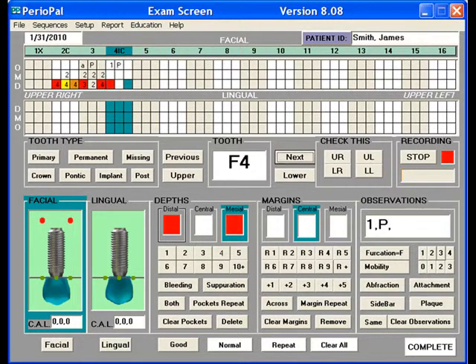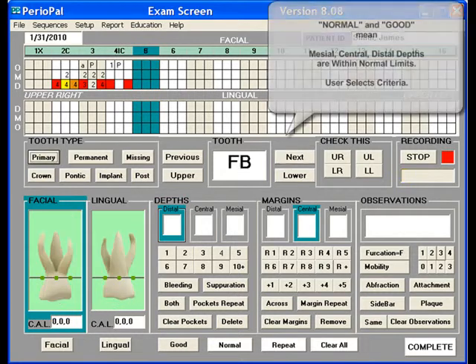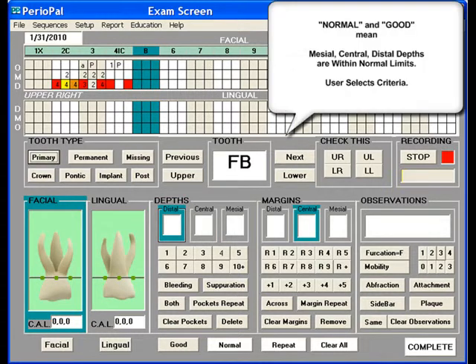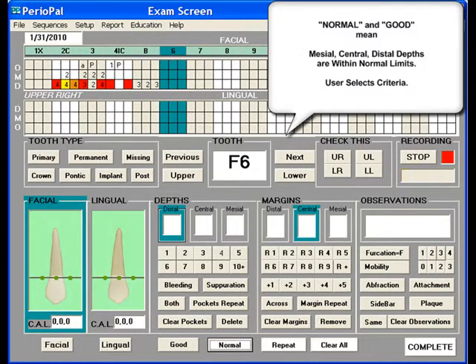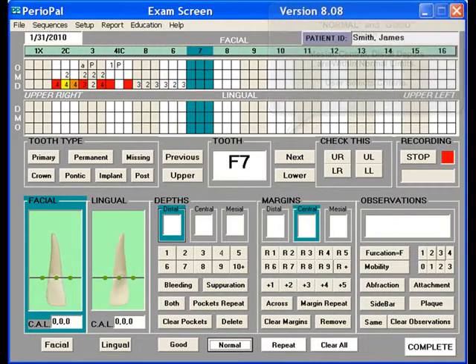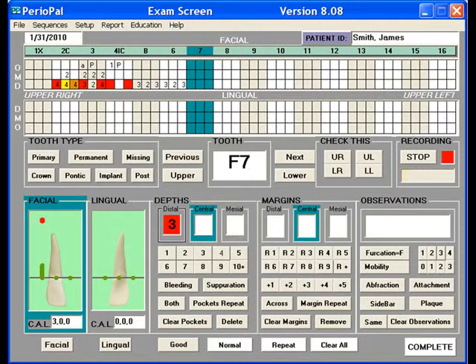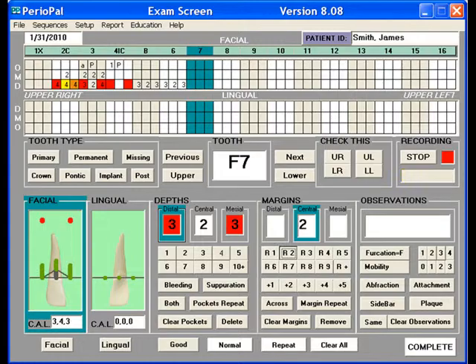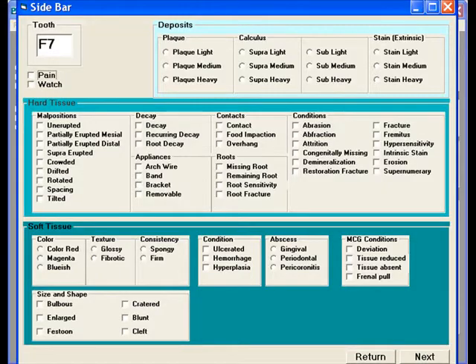Next. 5. Primary. Normal. 6. Normal, 3B. 2. 3B. R2. Sidebar. Contact. Root decay. Recurring decay. Restoration fracture.